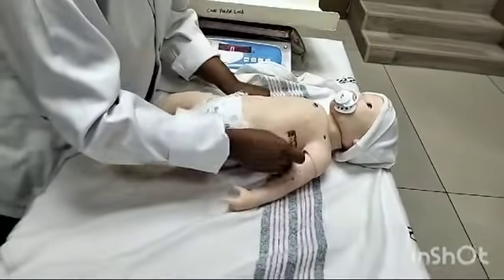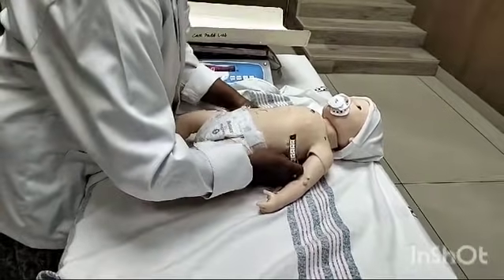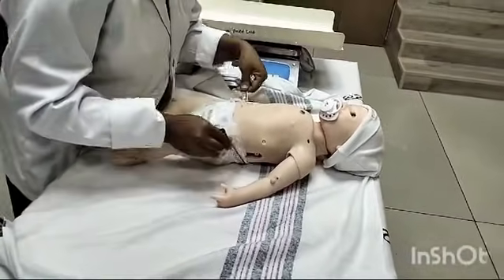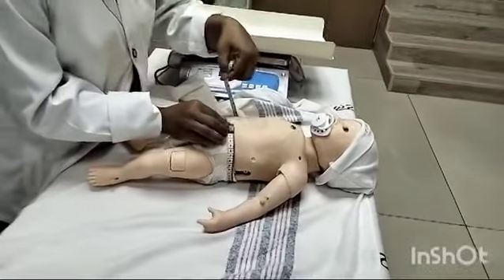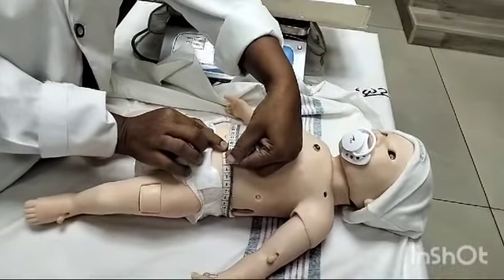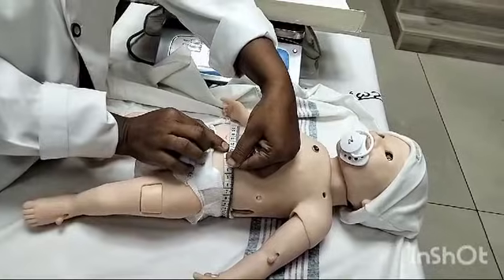After this, we can take the abdominal circumference of the baby — that is at the umbilicus. Here we will get the abdominal circumference.